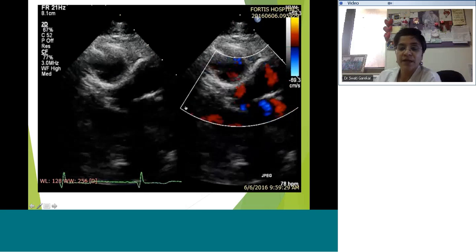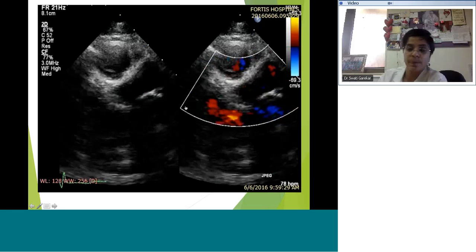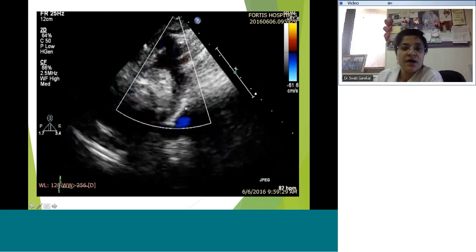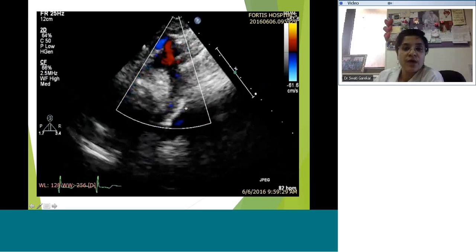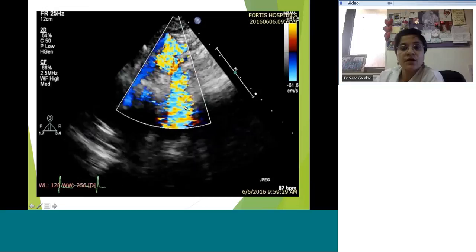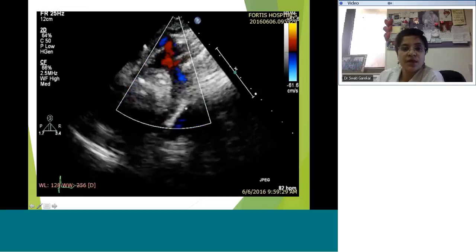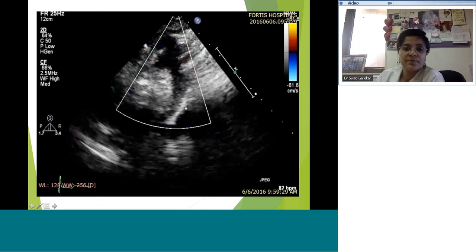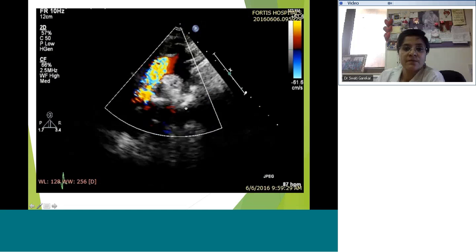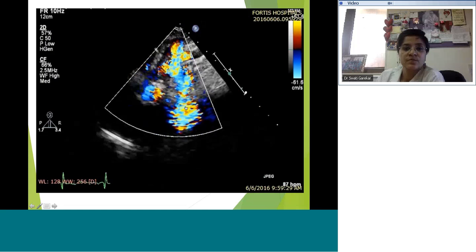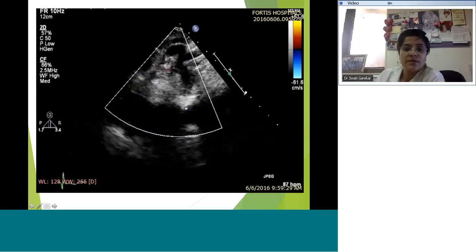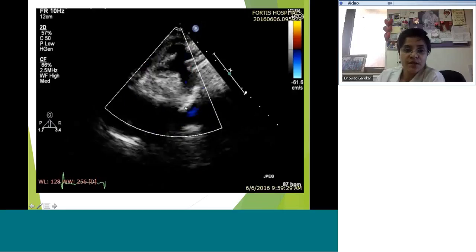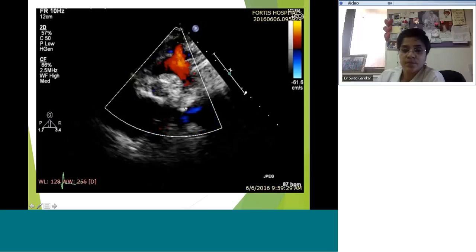We are doing a color Doppler of the descending aorta as per protocol, and there is flow reversal there. In the ascending aorta there is turbulence visible.